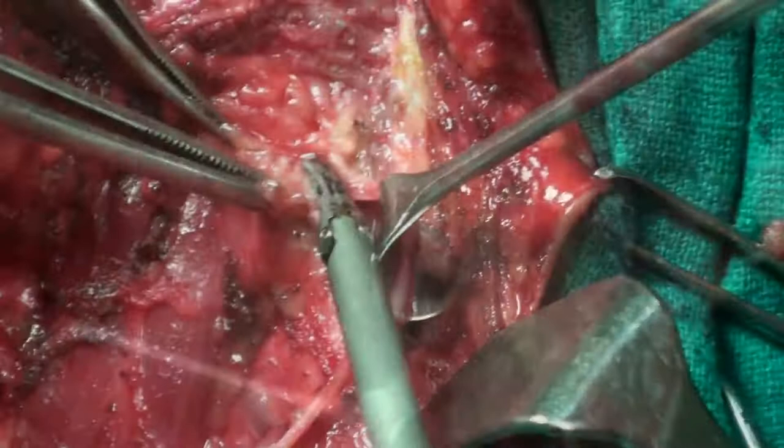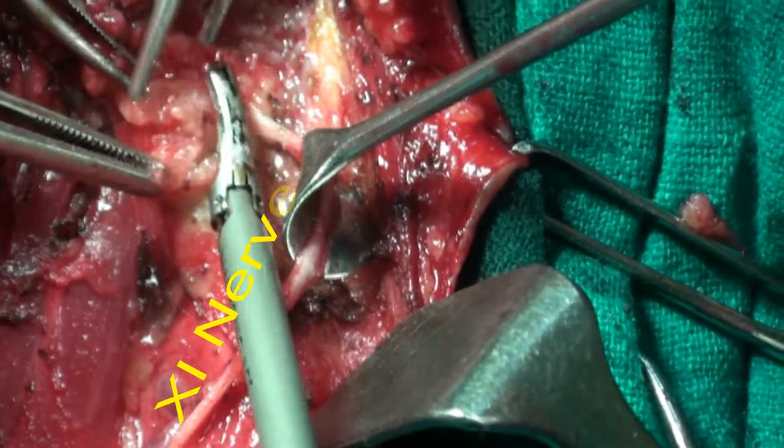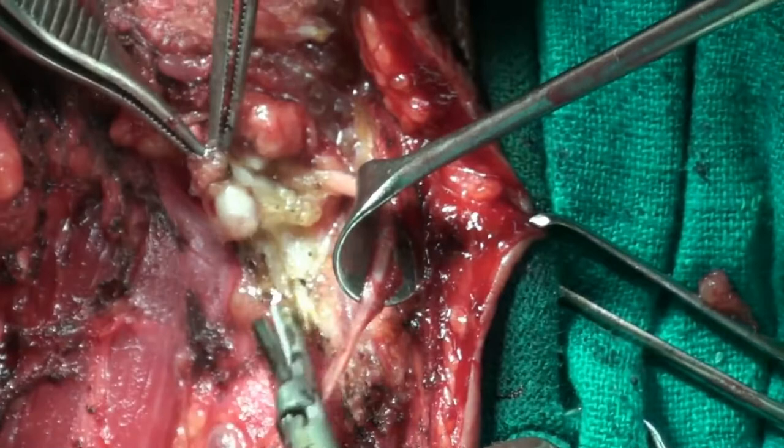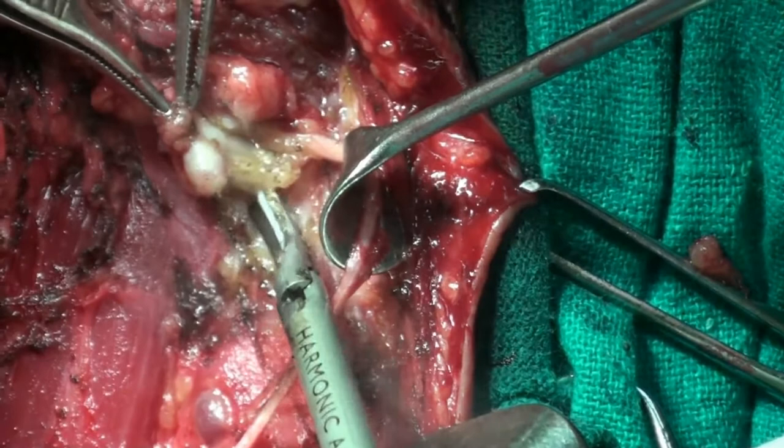See, I'm just going flush with the nerve. So 2B is down now. You know, can you see the nodes? Very nicely picked up, Siddharth. I can see the flow very clearly now. Stay there. I'm happy with that position. So don't try too much.